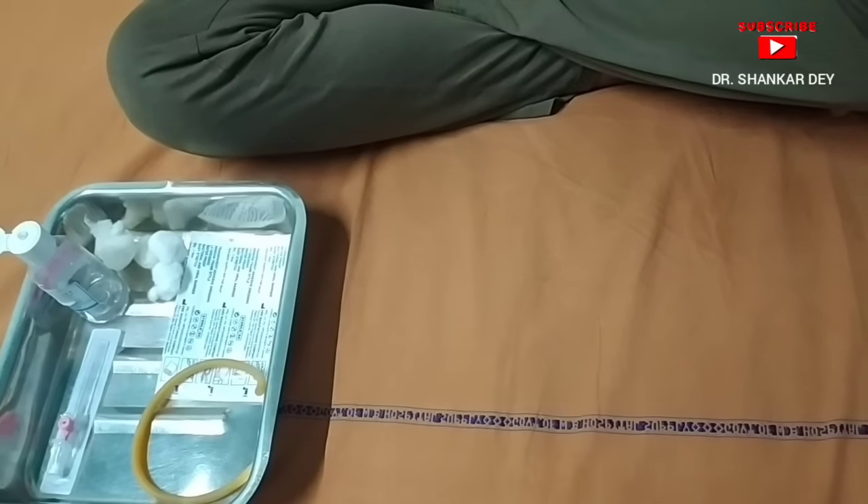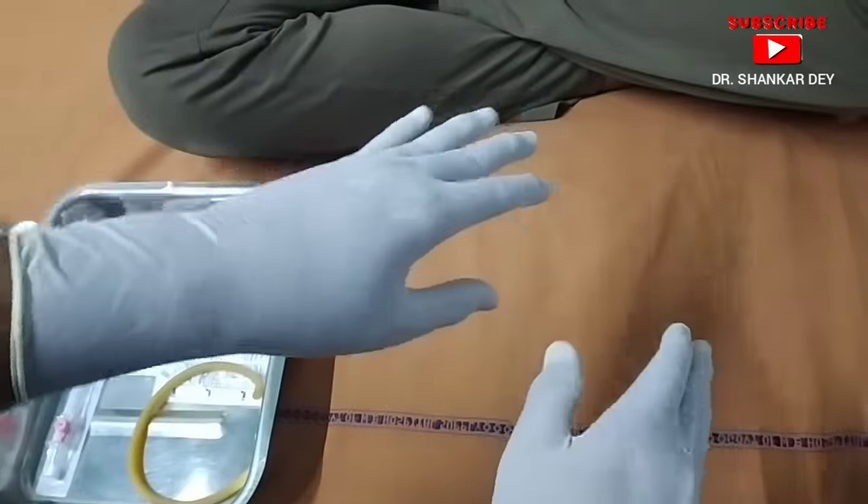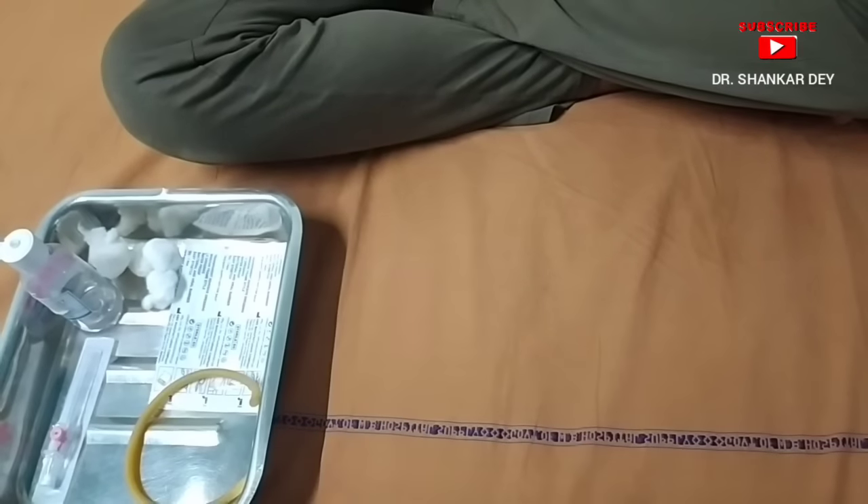The first step is to wash your hands properly and wear sterile gloves. As you can see, I have already put on the sterile gloves.